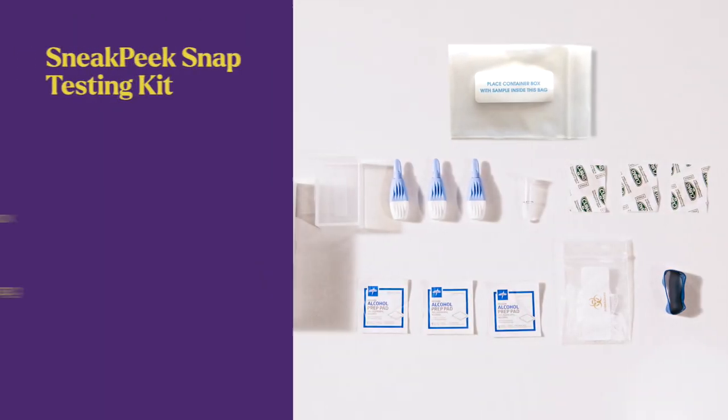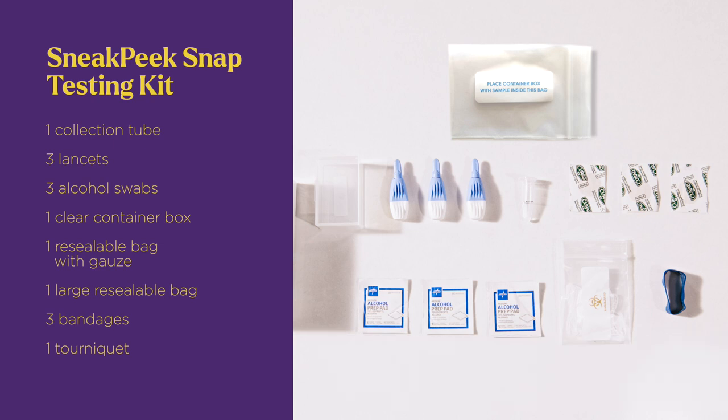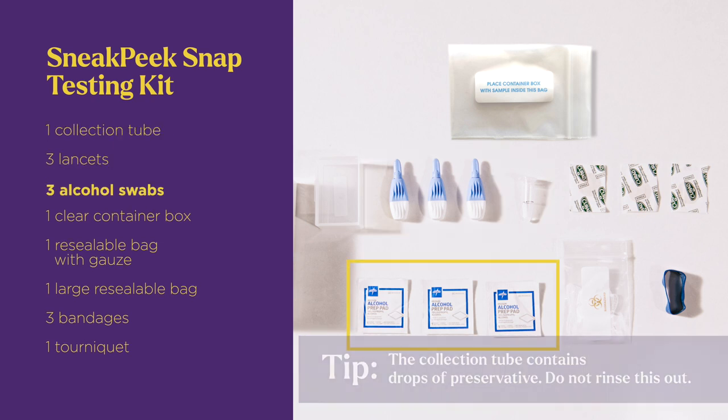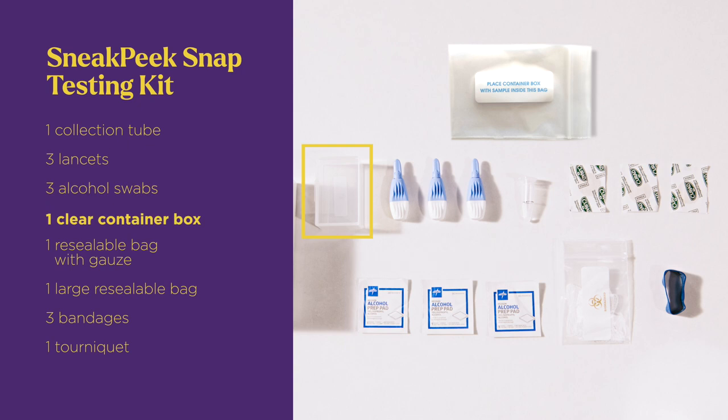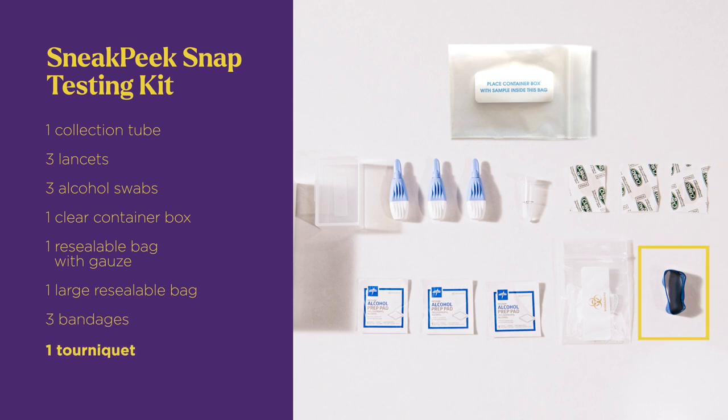Place the contents of the kit on your clean surface. Your test kit has a collection tube, three Lancets, three alcohol swabs, a clear container box, a resealable bag with gauze, a large resealable bag, three bandages, and a tourniquet.